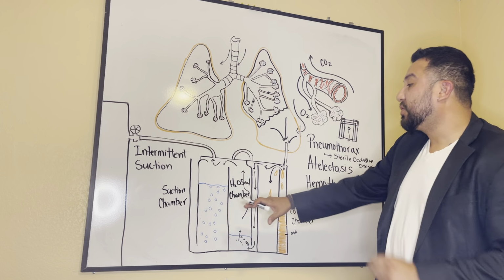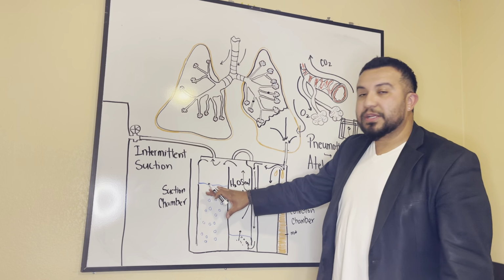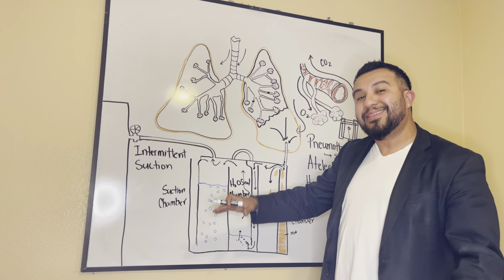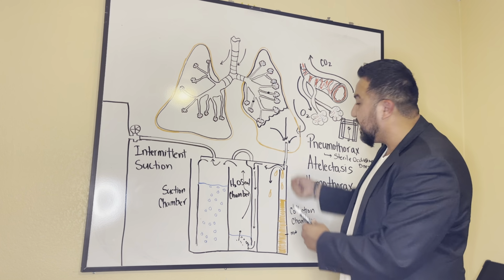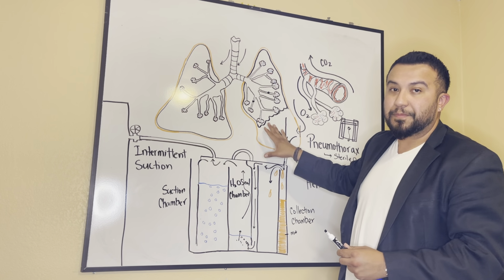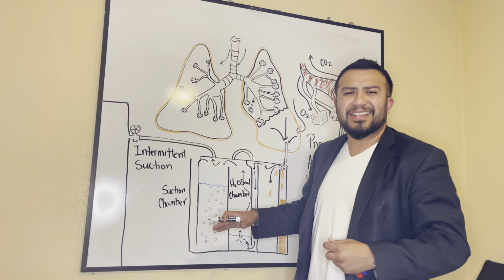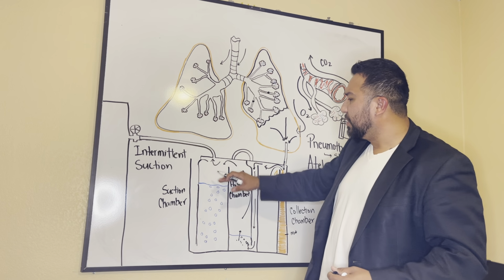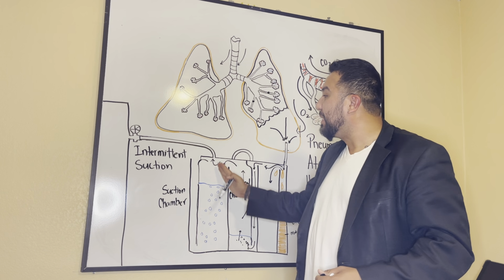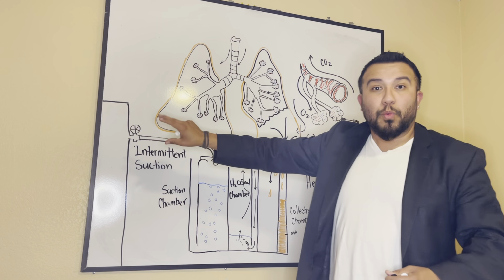Okay, so the suction chamber is going to have about 20 cms of water pressure inside, and this is what's going to be known as the control, which you don't have to really know about just yet, but just understand that the amount of fluid in here dictates the pressure that's going to be sucking, the force that's going to be applied to the removal of those gases that are inside the lung tissue, or the pleural space, excuse me. Now, what you will see in here is not excessive bubbling, but you're going to see more bubbling. There's more fluid. It's connected to the direct location where the air is being sucked out towards the suction device on the wall of the hospital.